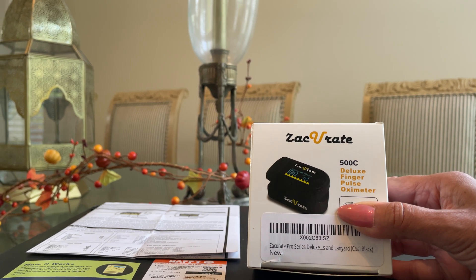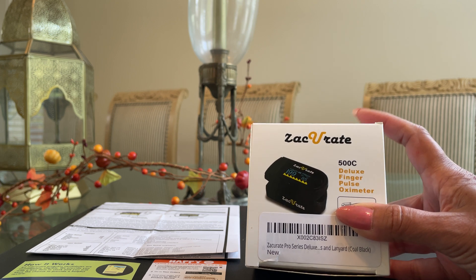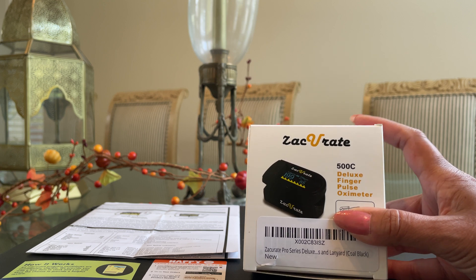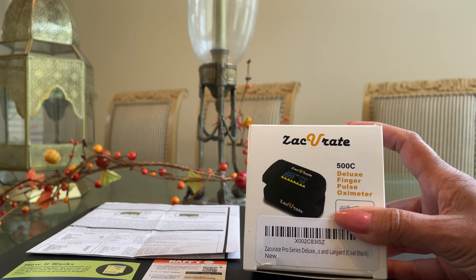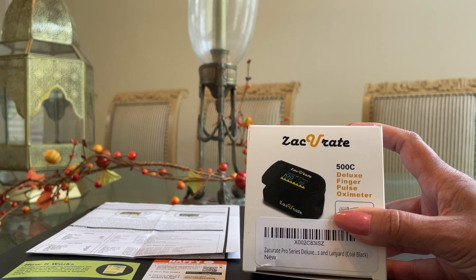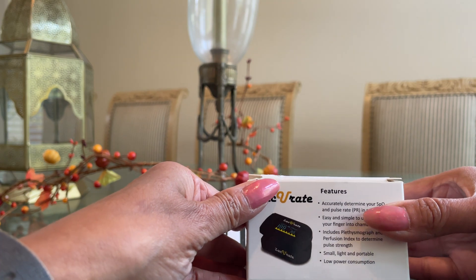Hello and welcome. Today I'm going to demonstrate the unboxing of my brand new Zaccurate 500C finger pulse oximeter. I promise you that you will all be an expert user by the end of this mini video. This cool electronic mini oxygen monitor is used at home to spot check your blood oxygen level and pulse rate. It's a very simple and easy to use device, and it also has energy saving features which I love.